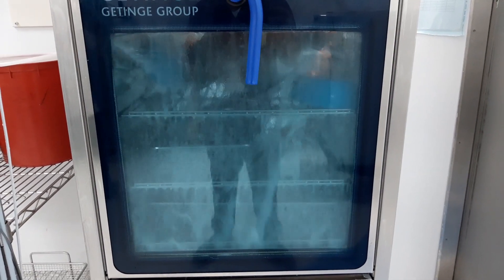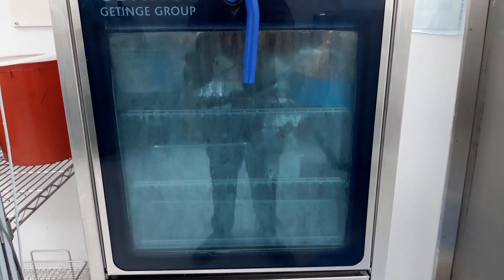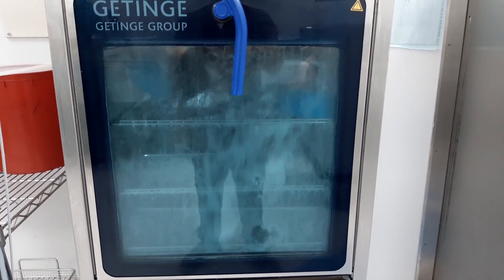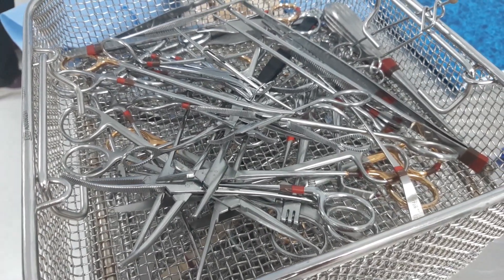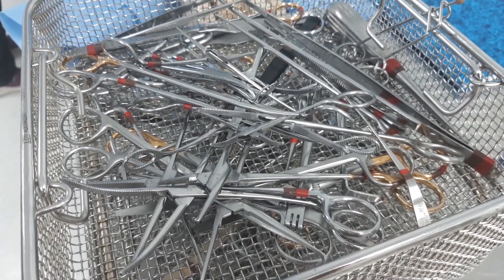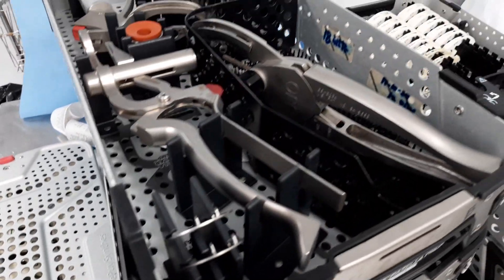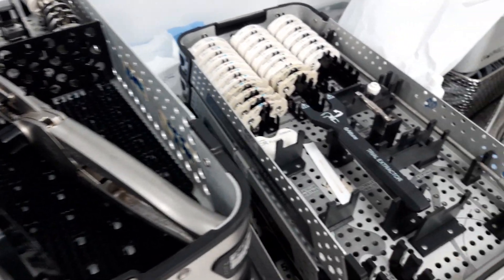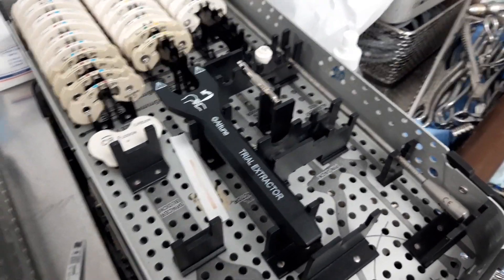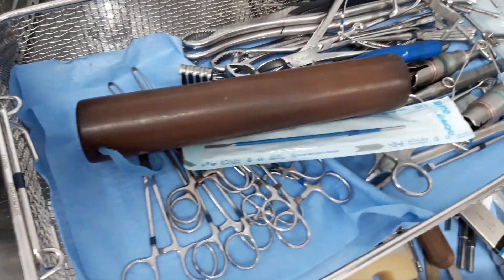A washer disinfector is used for the automated cleaning and disinfection of instruments in practices, clinics, dental offices, medical centers, and hospitals. The reliable monitoring and documentation of the relevant process parameters ensure standardized and reproducible decontamination procedures.